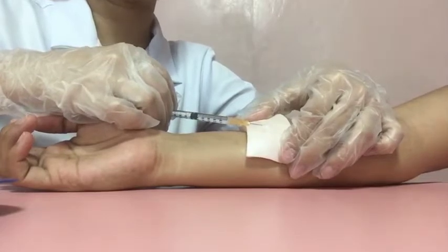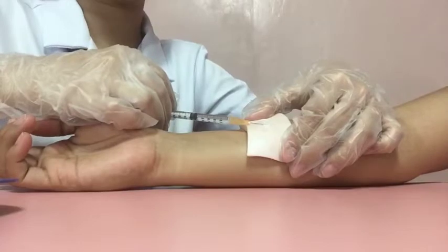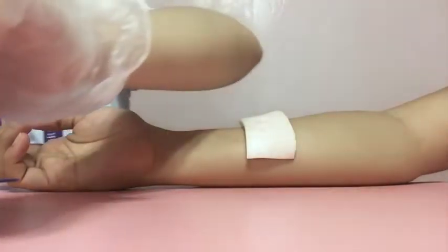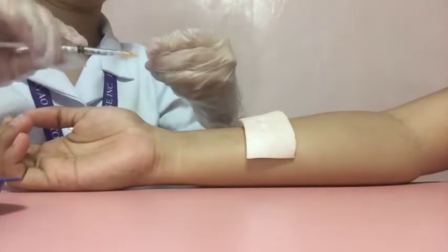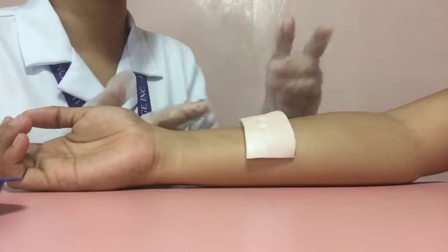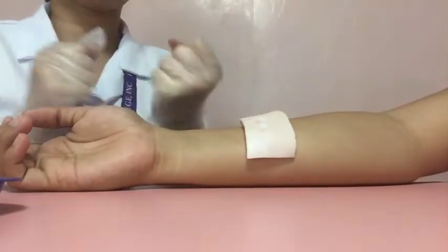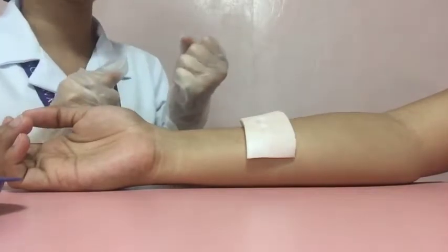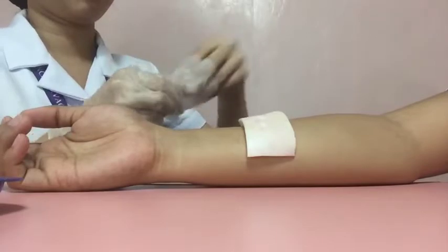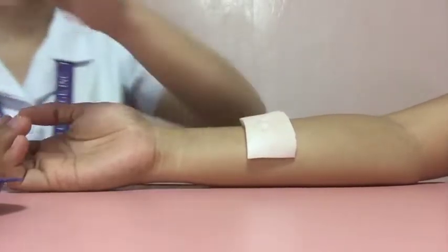Now, let's withdraw the needle quickly at the same angle at which it was inserted. So, activate the needle safety device. So, remember to not massage the area. So, massage can disperse the medication into the tissue. So, dispose the syringe and the needle into a sharps container. And, of course, remove and discard the gloves. So now let's perform hand washing.